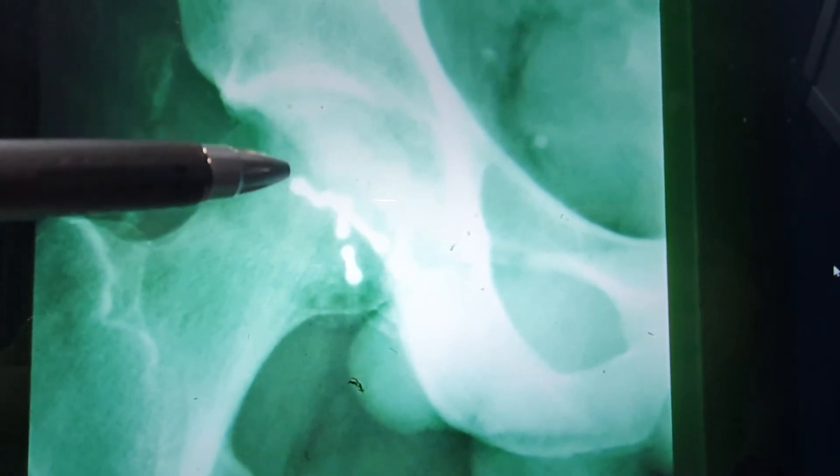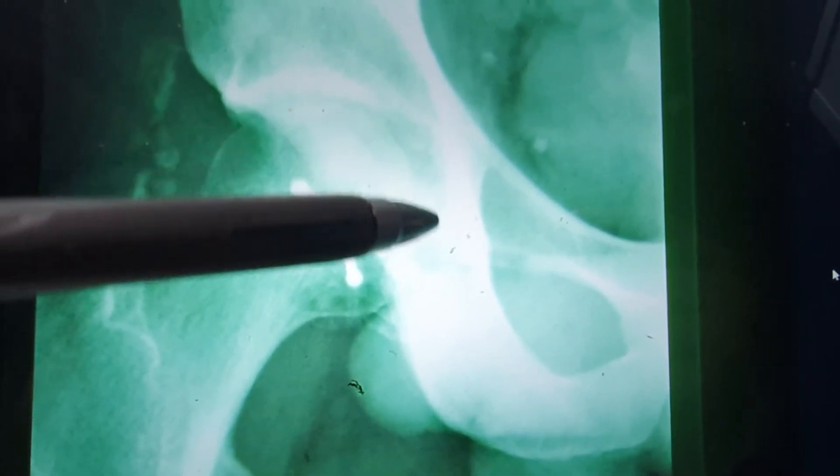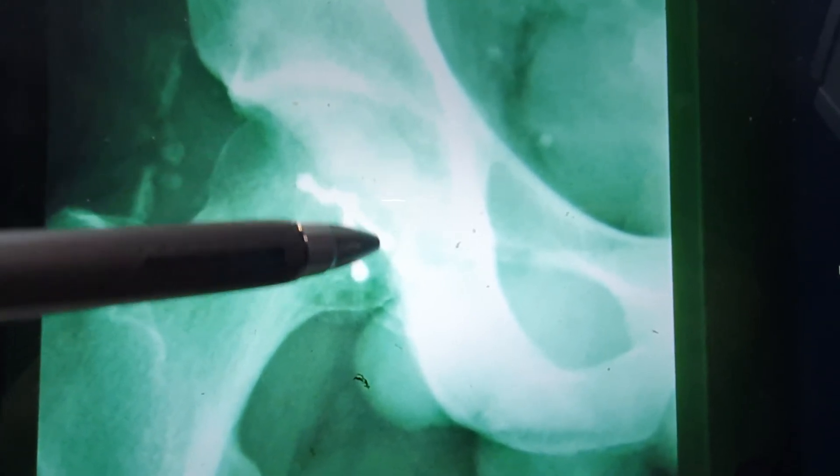This is at three months, but you can already start seeing signs of increased density of the femoral head. That may be suggesting that the blood supply to this femoral head is not so good despite the fixation. So you may be heading for avascular necrosis and osteoarthritis.